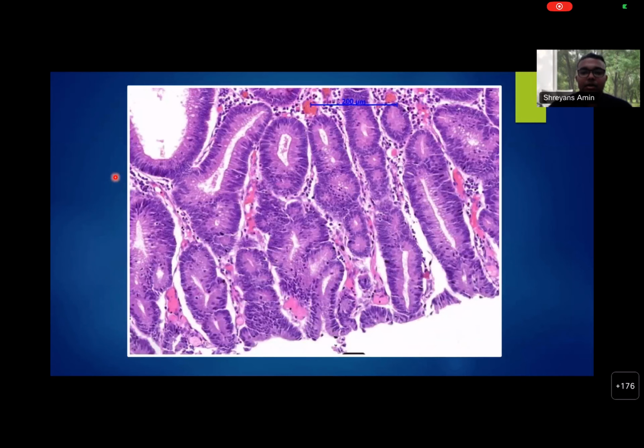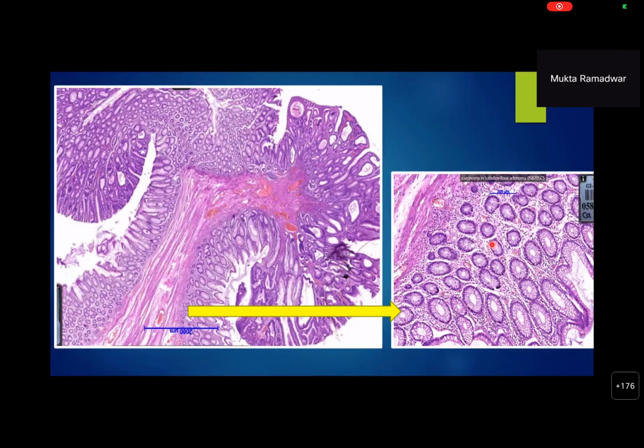Here, in this also, this is the same focus, but at still higher magnification. Now, all I want to focus on is we just saw this as a normal mucosa, which was present at the stalk. And I want you to compare the nuclear placement. Okay, first of all, the glands are all geometrically symmetrical. Yes. Okay, they look like flowers when you cut them transversely because they are simple tubules which start from the surface and end on the muscularis mucosa. And hence, when you cut them longitudinally, they would look like parallel test tubes. On the other hand, if you cut them transversely, they would look like a nice geometric pattern of, say, flowers. Okay, so that's the overall view.